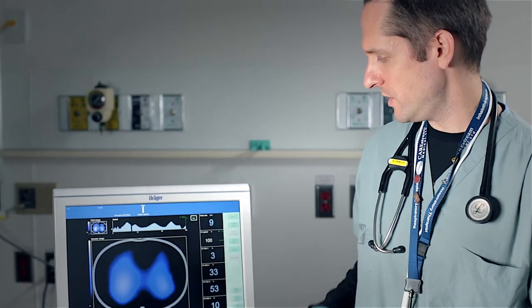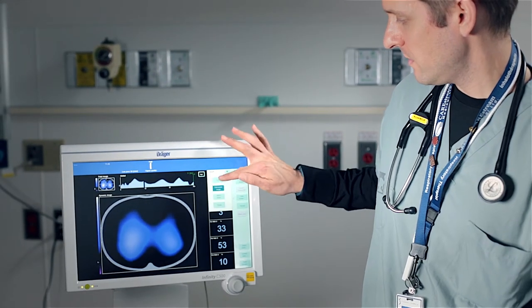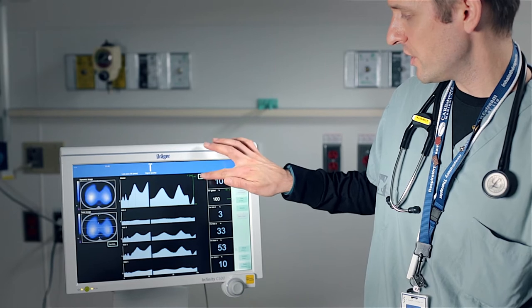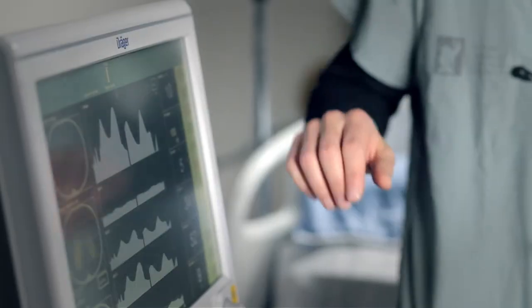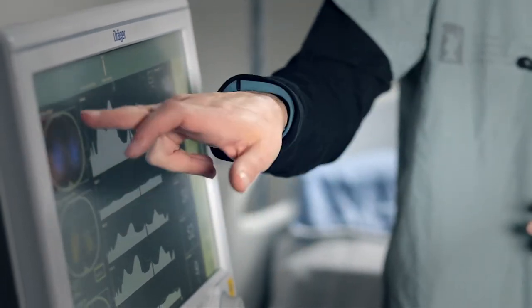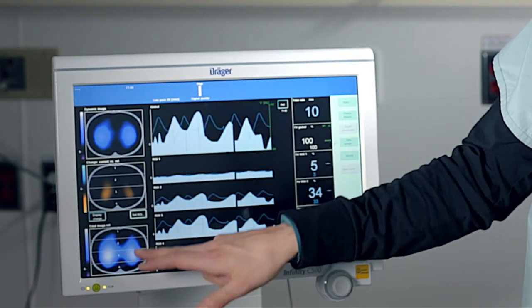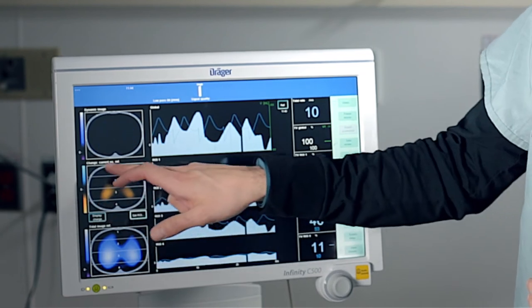My favorite screens to use at the bedside for teaching are the main screen where we can take a reference shot before we're going to make a change with the ventilator or make any adjustments. And then what we do from this screen is we can watch the real-time changes occurring in the lung compared to our reference by referencing this change screen.